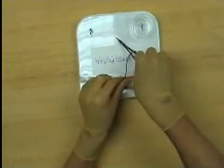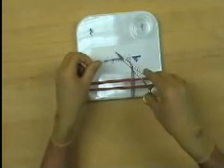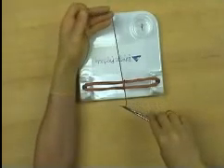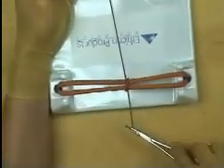Grasp the bite of the suture with the left hand, and hold the shaft of the needle holder with the right hand, so that it is above the suture and parallel to the wound. Form one wind of suture around the needle holder, then take hold of the tip of the tail. The first throw is then tightened, with the left hand moving away from the body.